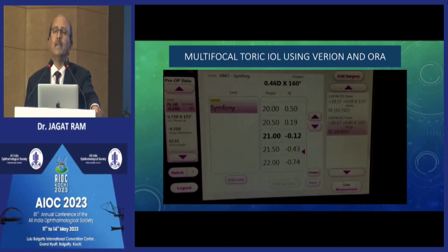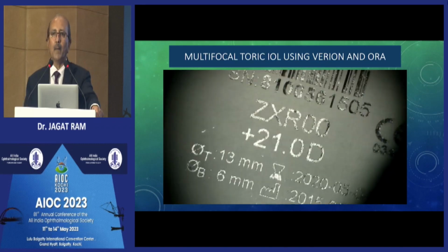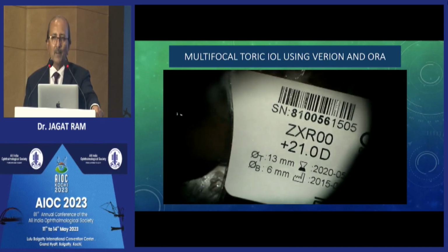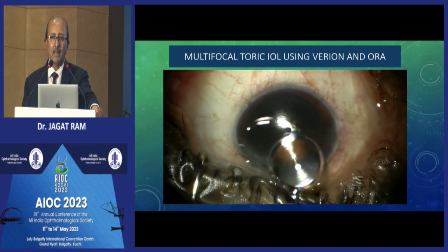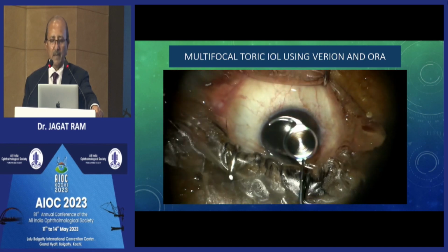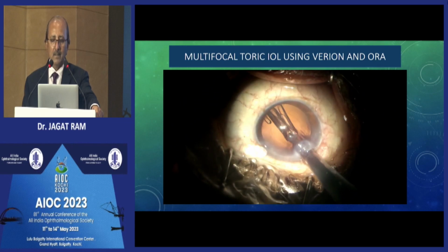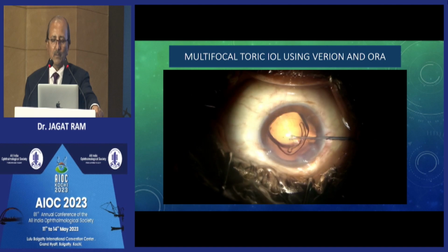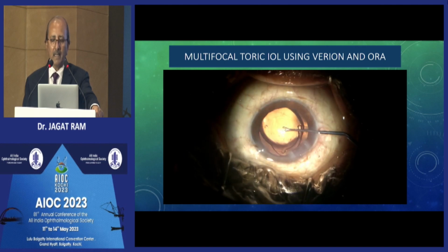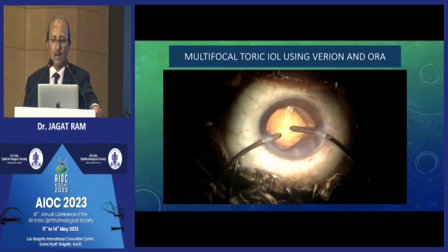But already we have done the power with IOL Master and other modalities, and we match whether it is the same or it differs. But it is very accurate. So we have done even comparison of this Aura with the other modalities.